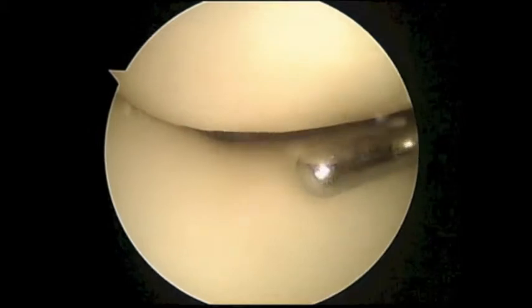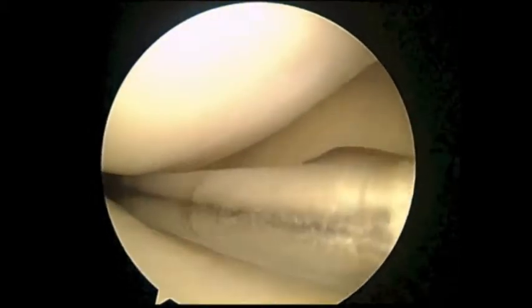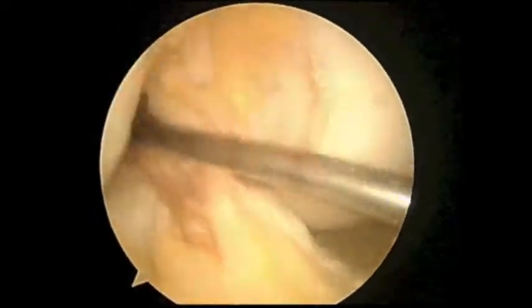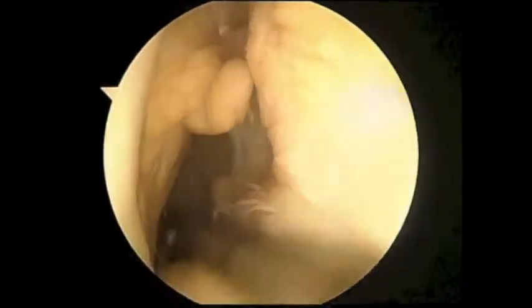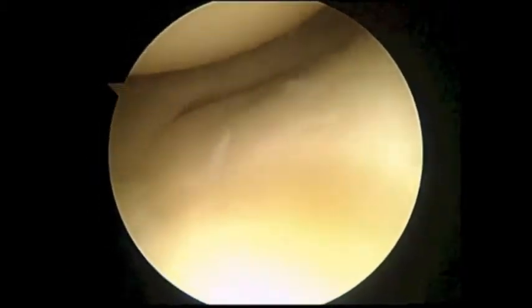When we first get inside the knee, we take a look at the cartilage underneath the kneecap as well as the groove that the kneecap slides in. And we want to look at the medial meniscus and the compartment containing cartilage inside the knee. We're going to inspect our ACL and see if that's torn as the MRI indicated. Here you can see the ACL is completely torn away from its attachment, which should attach here on this wall of bone inside the notch at the end of the thigh bone.